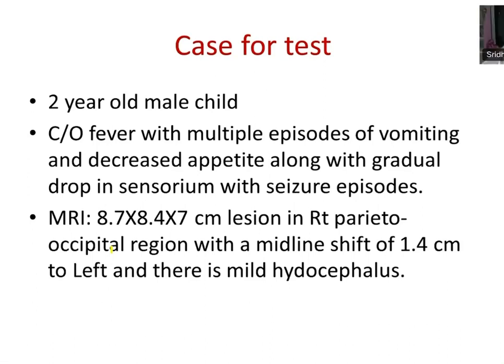No, sir. So both these tumors, ETMR and ATRT, are high-risk embryonal tumors. They're always clinically stratified as high-risk group tumors. So use your IHC panel. It will help the clinical colleagues to stratify these babies into high-risk protocol and treatment, and prognosticate further.